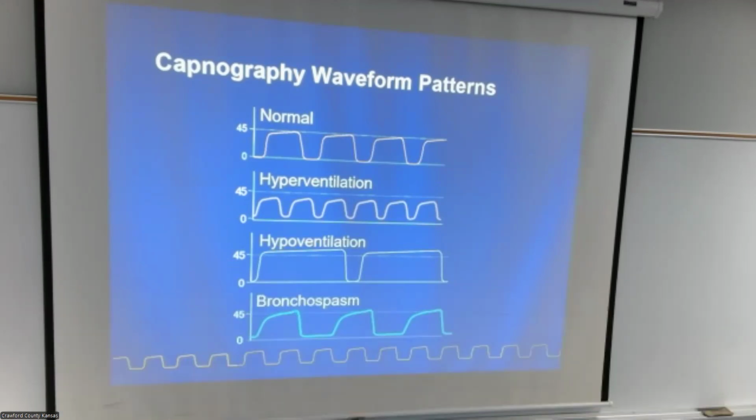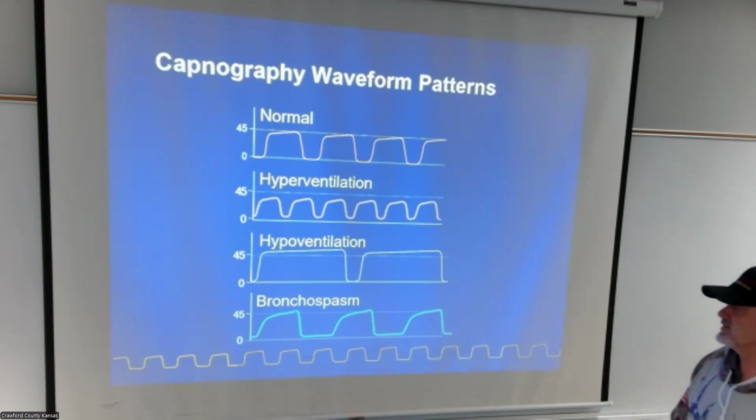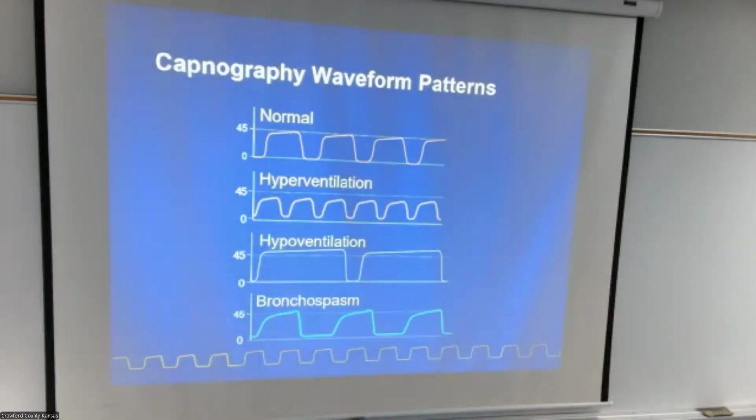So now we have a normal, a hyperventilation, hypoventilation, and of course a bronchospasm. You're going to see some of your emphysema COPD patients. Well, you'll also get some shark fins on them as well, secondary to the same thing.